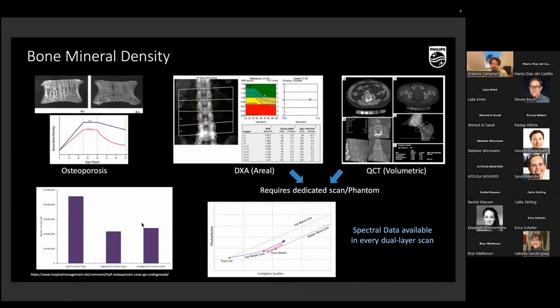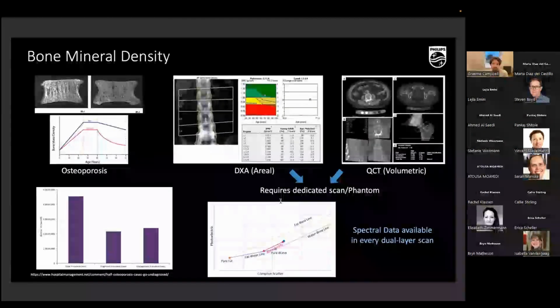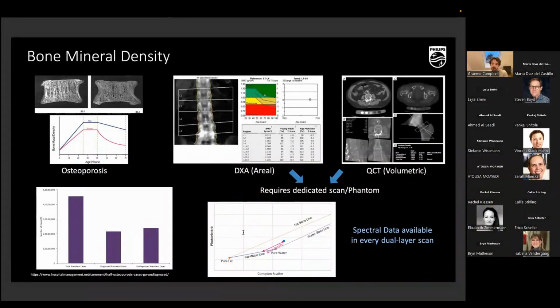So there, I think, is a big opportunity here, because this is what's resulting in this treatment gap of osteoporosis. We could narrow this by already detecting low bone mass in these patients, because we have all the information. It's already there. We need to get it. So here we could, from the scan, get the BMD, and then would have that score.